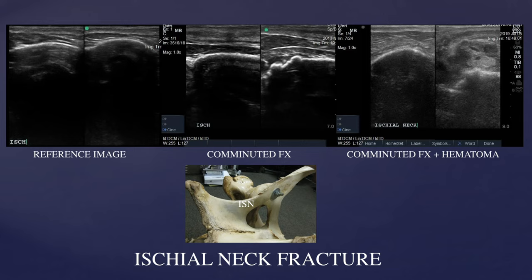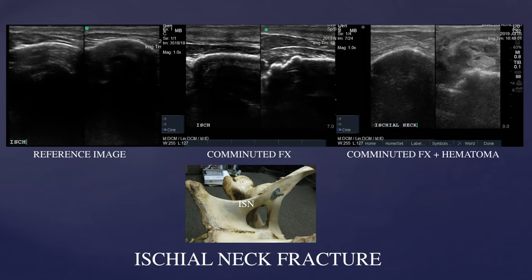Slide four demonstrates fractures of the ischial neck. There are normal reference images of the ischial neck in the top left — just a curved section of bone. The central image shows a normal reference on the left but fracture fragmentation on the right ischial neck. The most right-hand image shows a normal reference of the ischial neck on the left but significant fracture fragmentation on the right, along with a hematoma because of how acute this particular fracture was — caught at the time the hematoma was associated with the fracture fragments.